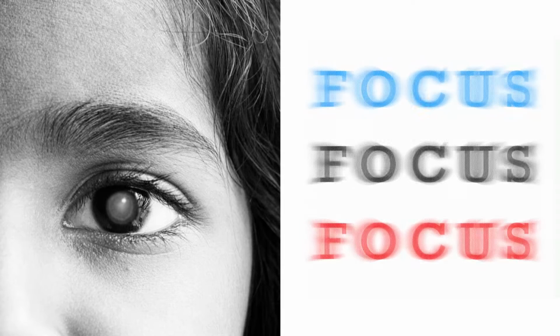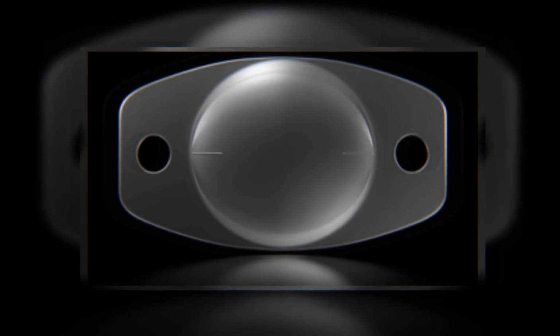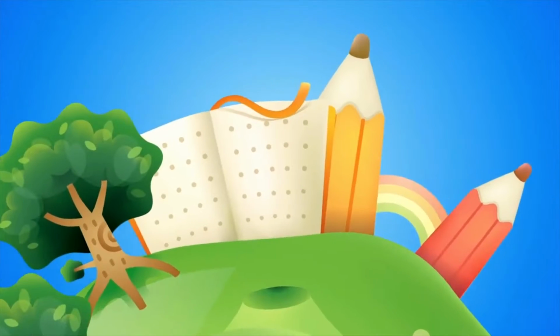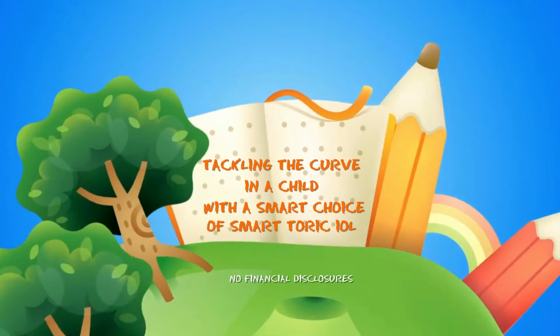Uncomplicated pediatric cataracts with high astigmatism are itself quite a task to handle. Now here is one of the first few cases to be implanting a SMART TORIC IOL in a child with a complex cataract, even with a posterior capsular defect and high astigmatism. And this is what would be described in the video, Tackling the Curve.